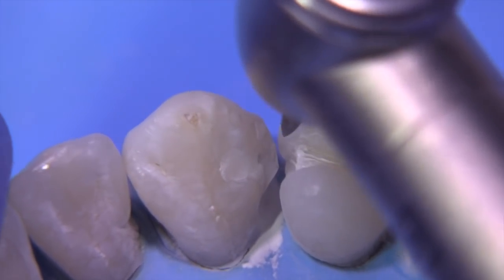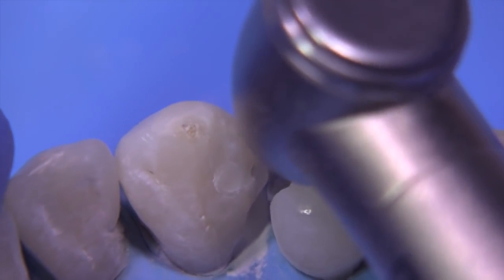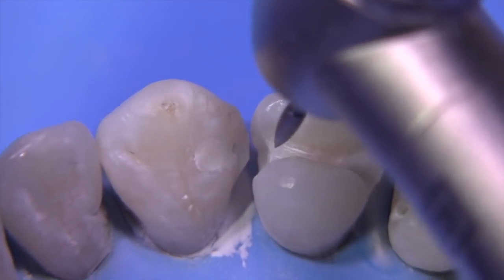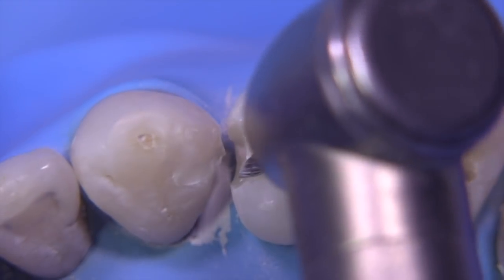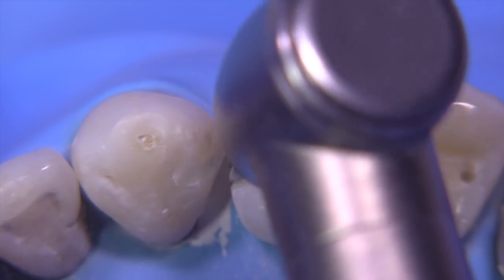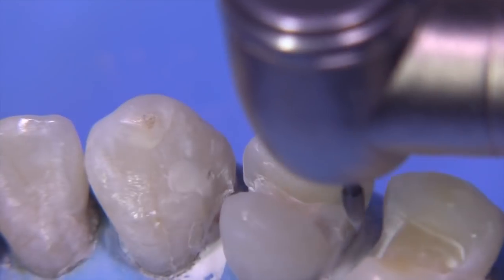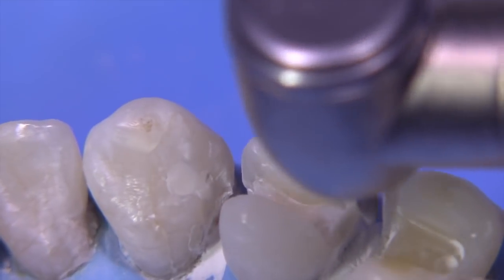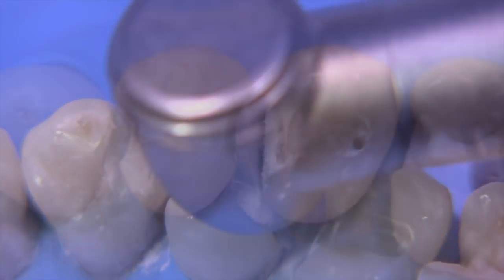The 7102 carbide is excellent for getting into these interproximal areas and starting the hollow grind. The hollow grind procedure is difficult to do when you don't have a lot of access because the burrs are necessarily wider. In this particular case, we'd already prepared the MO on the second premolar, and we're going to be preparing a DL on the canine, so we're not worried so much about hitting the adjacent tooth. This 7102 is a skinnier carbide than the 7404 and it's able to get interproximately a lot easier. You can see the basic concavity that you're creating. You want to be careful not to make a feather edge margin; this should end up being like a chamfer. This burr is great for the initiation of the hollow grind, but it's not very good for the completion because it's just too skinny.